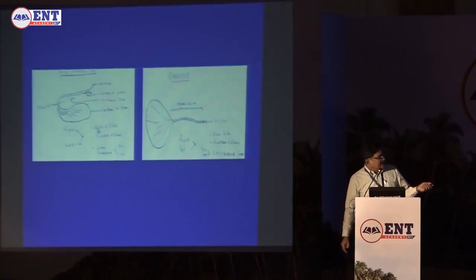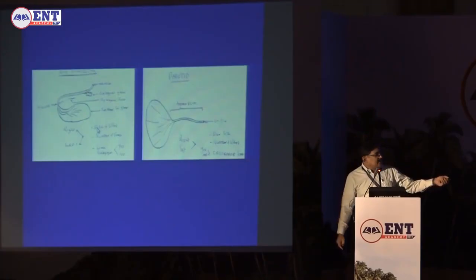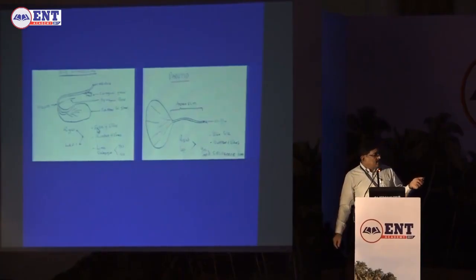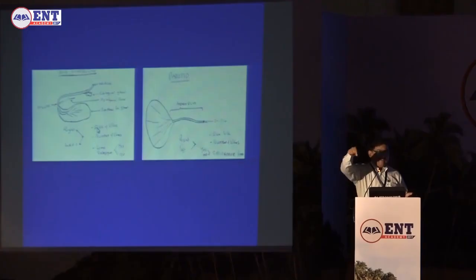This is the orifice, sublingual gland, duct, hilum, and this is the gland. This is the submandibular, parotid. Radiologists write one page of report, but you ask them just to mark where the stone is, what the size is. This will be much more accurate than one page of written information. So all the cases now, including some of my colleagues, have taken up this kind of diagram, which we send as a blank, and the radiologist just draws where the stone is and sends it back. This is more useful for practice.